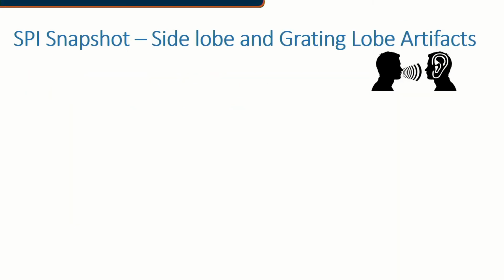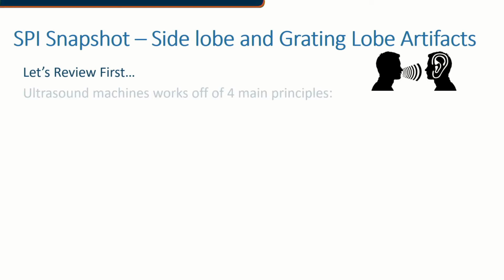All right, for our snapshot today, I want us to talk a little bit about side lobe and grating lobe artifact, because this is something that you may see anytime that there's a fluid structure that you're trying to look at. Now, first I want to do a little review before I explain exactly what's happening with these side lobes and these grating lobes.